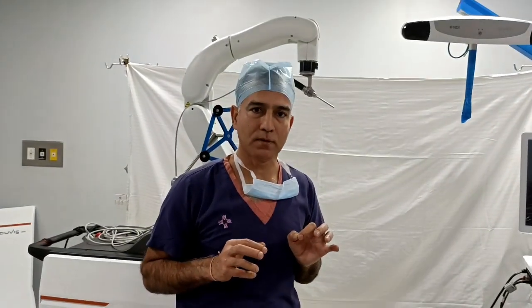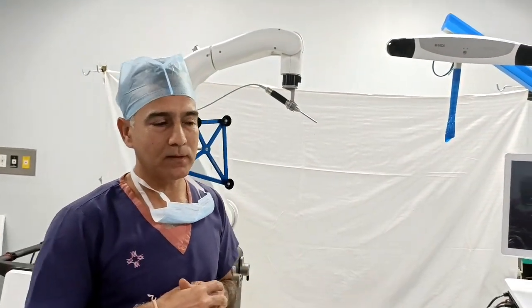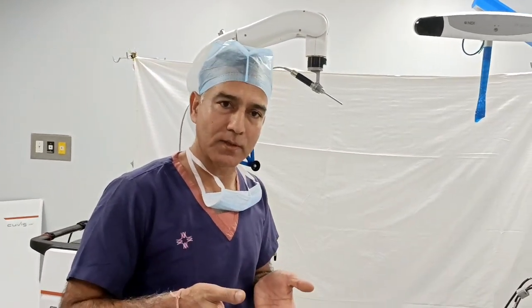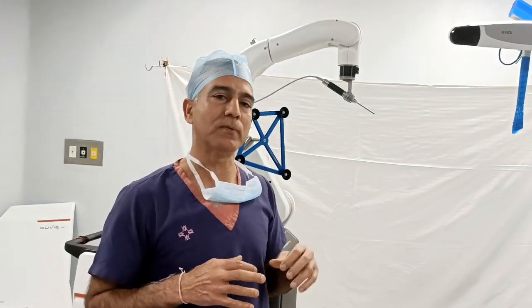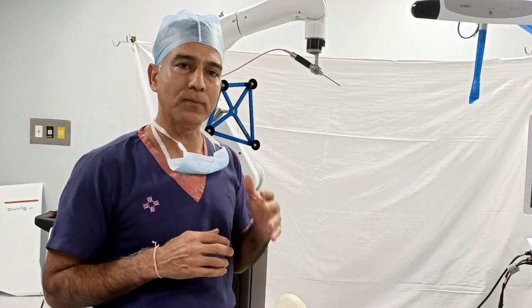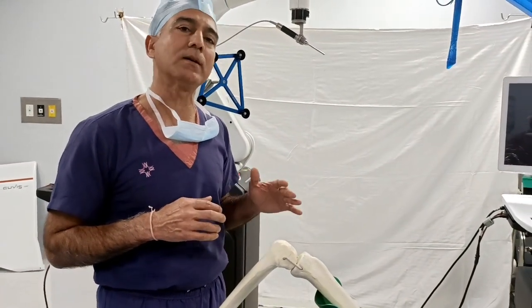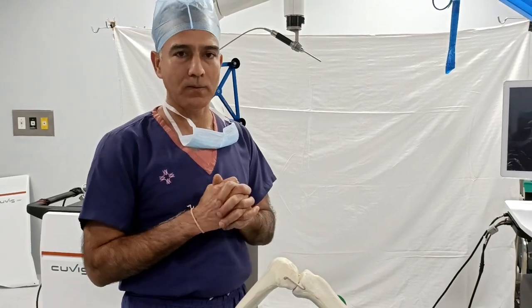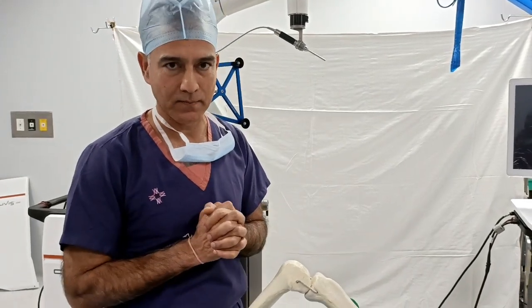This is the world's first fully active robot. Previous robots were semi-active — surgery still had to be done with an arm manually. But now we feed the bone structure and deformity data, and the robot will automatically cut the bone. This is the world's first fully automatic robot, and we are giving this facility to our patients.